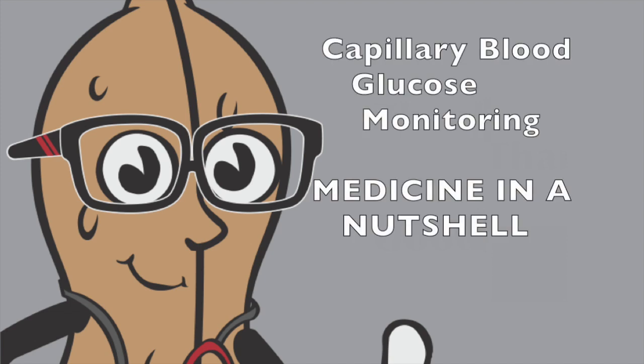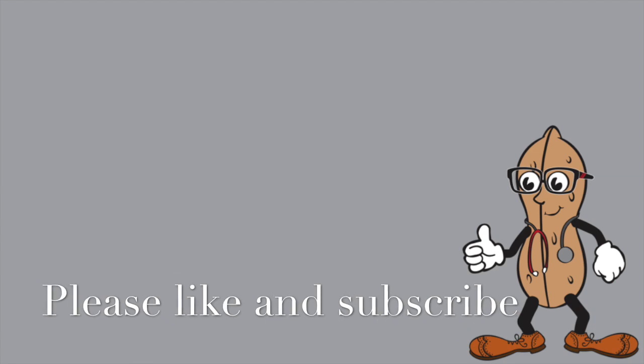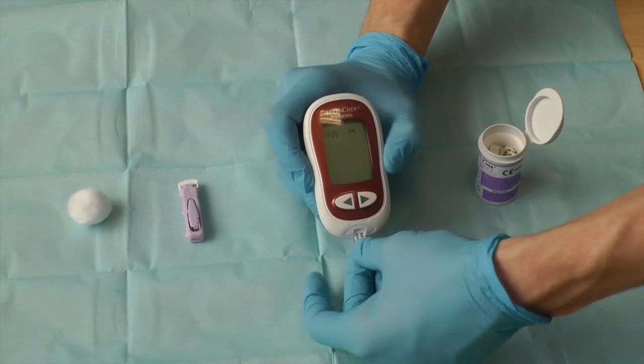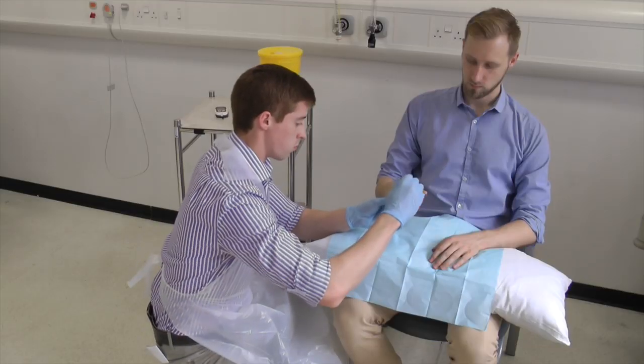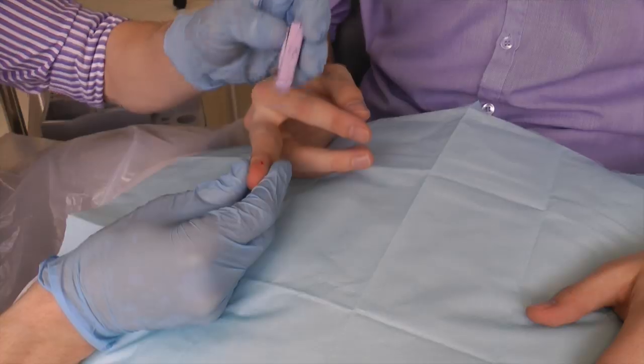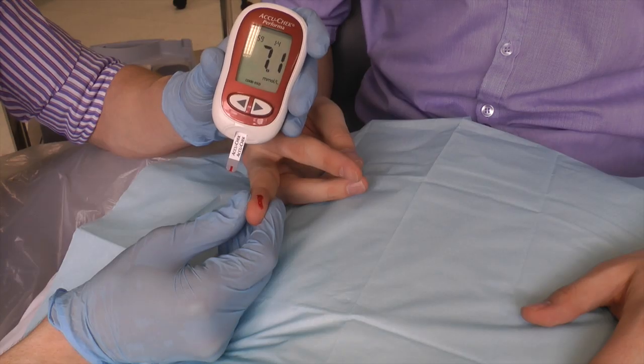Welcome to Medicine in Nutshells Guide to Monitoring Blood Glucose. The steps involved are: prepare arm and lancet, clean and puncture skin, apply testing stick, and use cotton swabs to gain results and document.